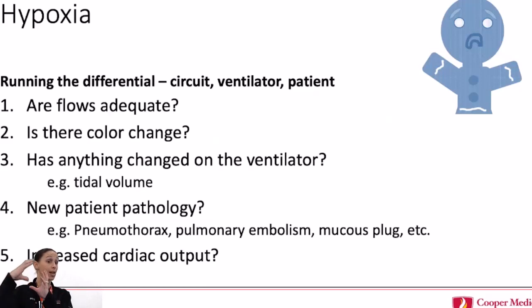Let's take now a septic patient. Let's say now that the cardiac output is 10 liters a minute. Now, proportionally, we're only able to oxygenate about half their cardiac output in the circuit. So there are scenarios, you've probably seen us do this: heart rate's really high, they're febrile. We sometimes will give a beta blocker to lower the native cardiac output so that more of it is captured with the circuit and oxygenated with the circuit.